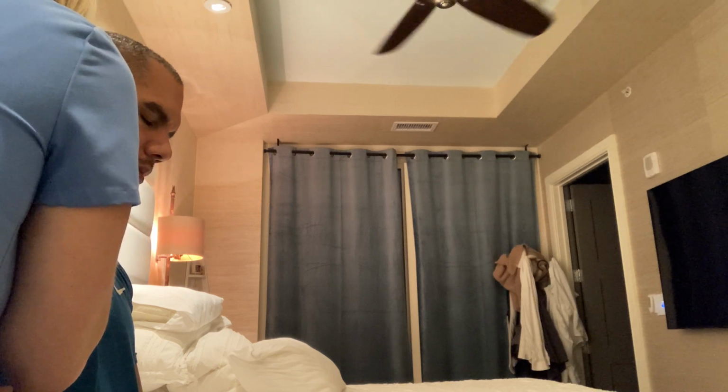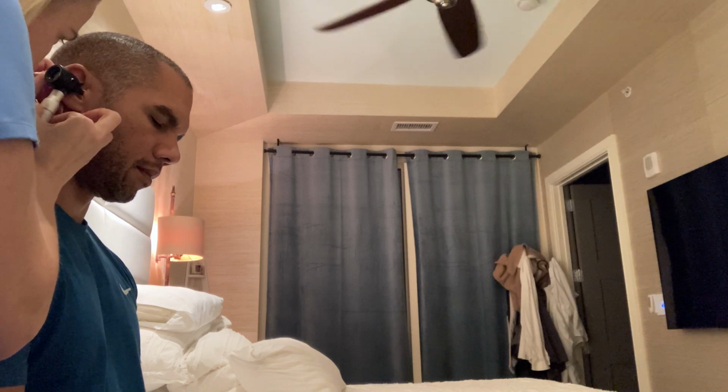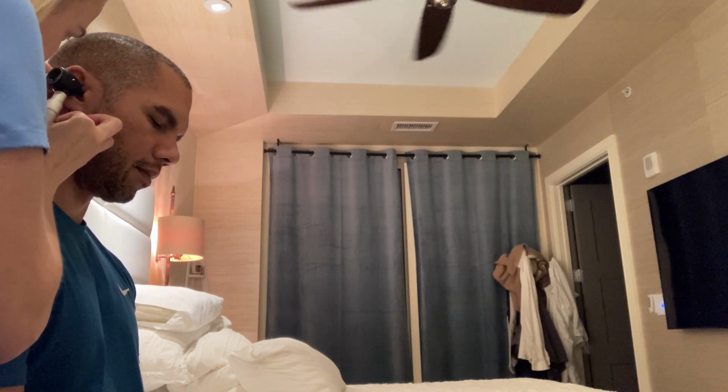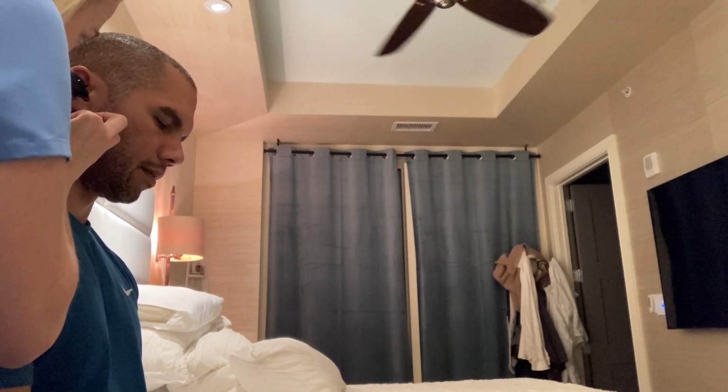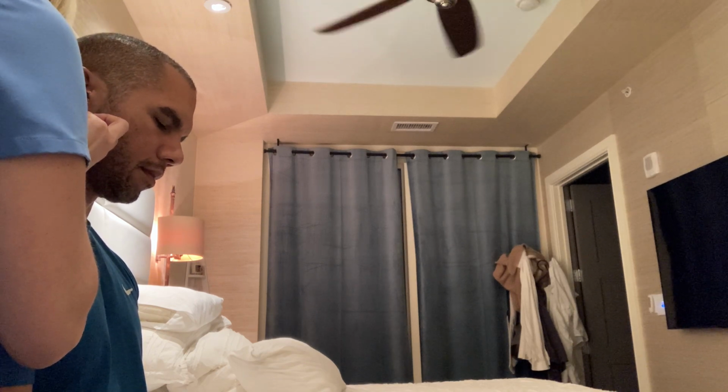All right. Same with the up and back. Same with the right ear. And I hold my finger here against Randall's cheek to make sure that I don't bump him with the otoscope. Okay. All right, Randall, what I'm going to do next is something called a whisper test.